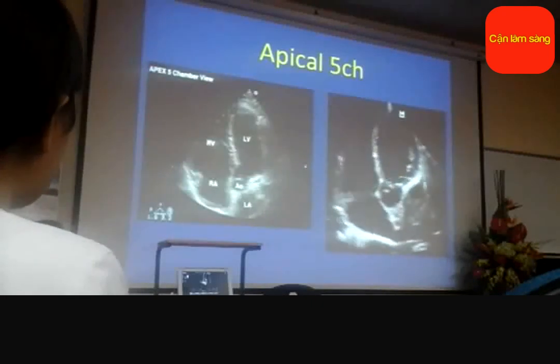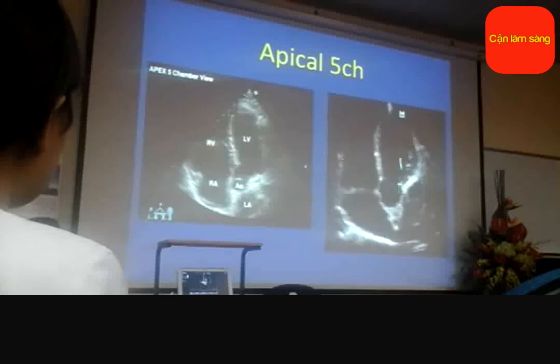But here's an example looking with the apical four chamber angling up to see the aortic valve.